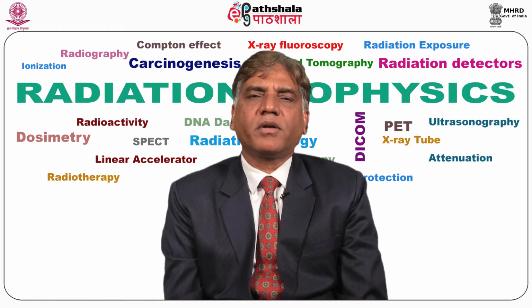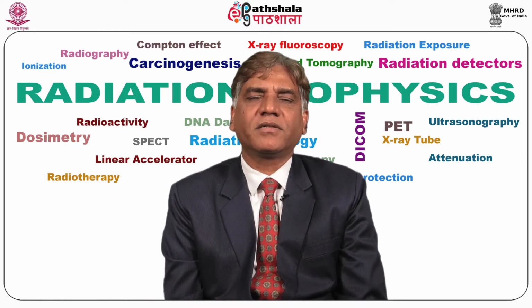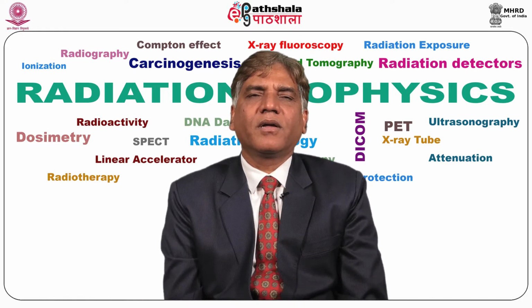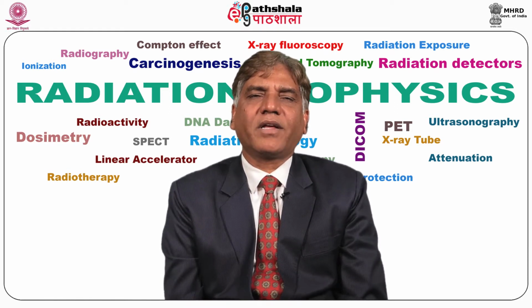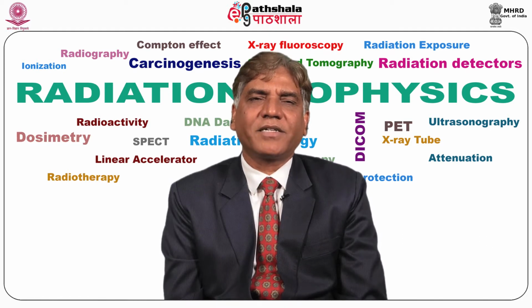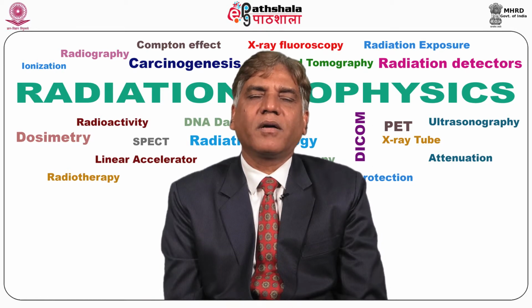Coming to the pulse wave Doppler, it provides the means for detecting the depth at which a returning signal has originated. The depth can be positioned via cursor at any point along the axis of the pulse Doppler beam. To determine the Doppler shift at a specific depth requires that the ultrasound transducer produce a very short duration burst at a precise rate of repetition, known as pulse repetition frequency, which determines the maximum depth from which a Doppler shift can be detected. The advantage of pulse wave Doppler is that it can identify the source of the signal.